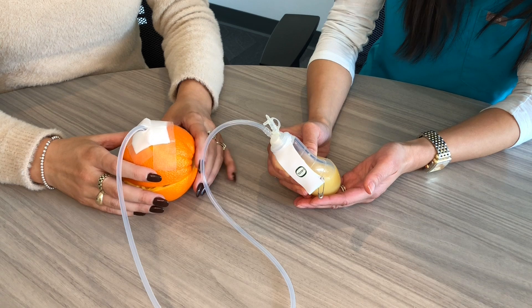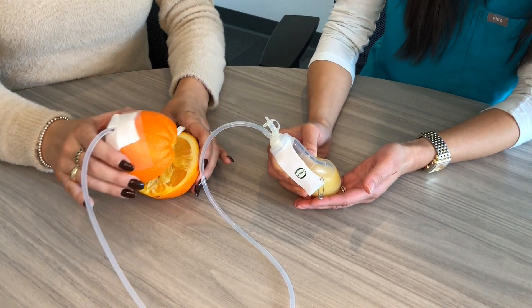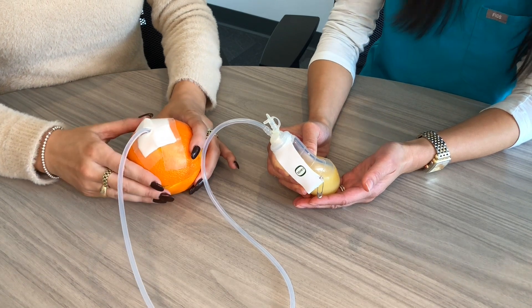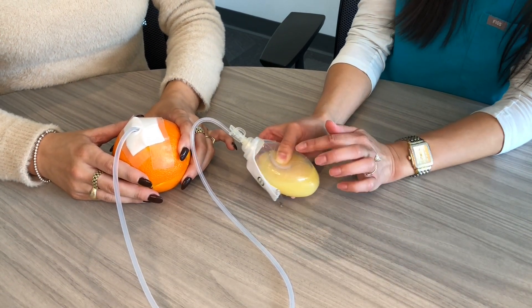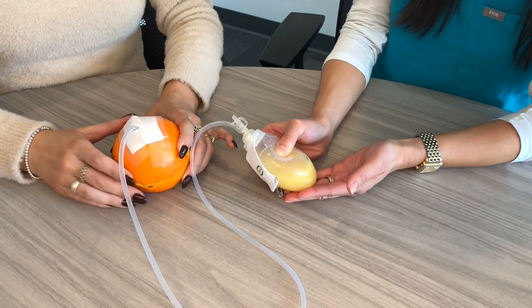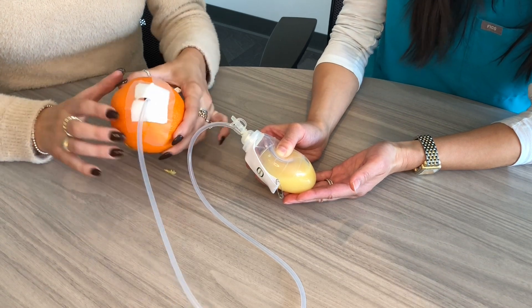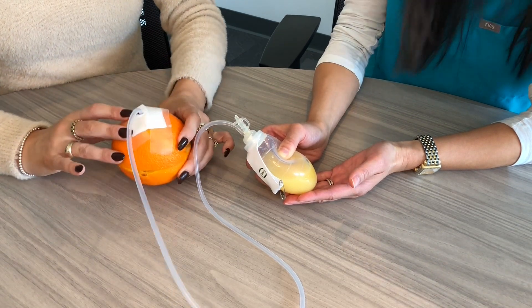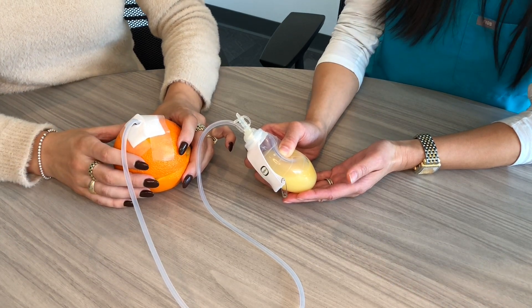The drains we're talking about today are called Jackson Pratt drains, JP drains, or sometimes Blake drains. Whatever they're called, these are drains that empty into a little bulb outside the body. The bulb provides a constant low suction to pull out air or excess fluid from your surgical site. This helps the wounds heal faster and prevent some complications. It stays in until your provider removes it — you won't have to take it out yourself.